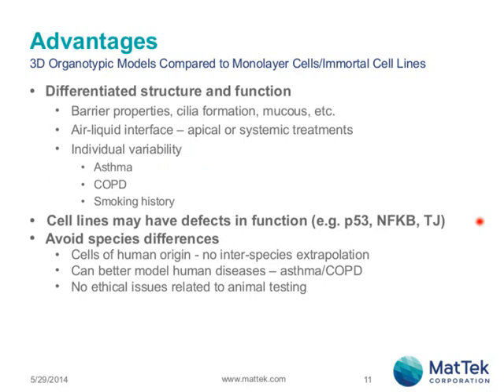Regarding cell lines, I know there are a number of common cell lines, and a lot of people have done a lot of nice work using a variety of cell lines. We prefer, again, to not use cell lines. Mainly, we prefer to use normal human cells. So I guess by definition, the immortalized cell lines, just by the very fact that they're immortal, are not normal, especially if you're studying things related to proliferation or cancer, et cetera. And oftentimes, they may have deficits, defects in their function. For example, A549 cell line commonly used for alveolar doesn't have appropriate barrier. Another advantage of using primary human cells is that we avoid any species differences compared to using animal cells.